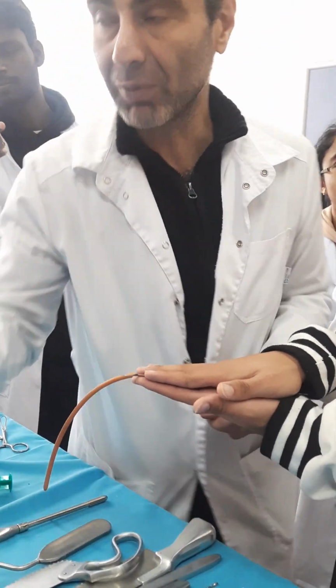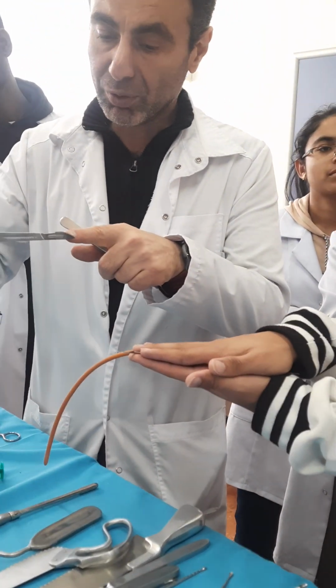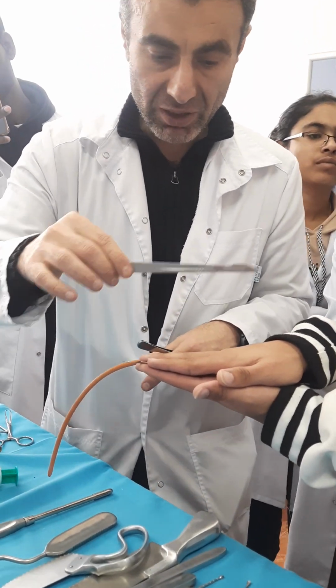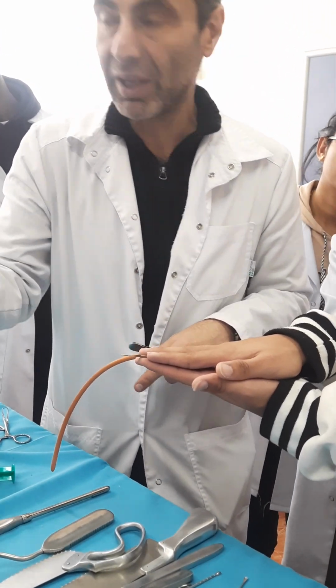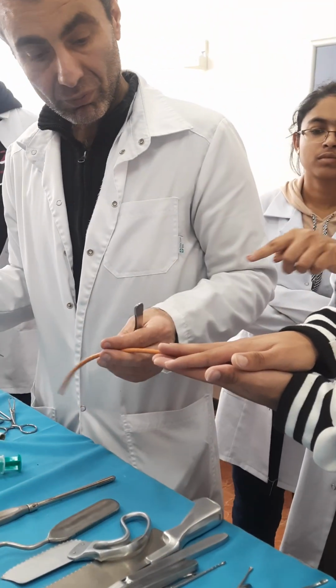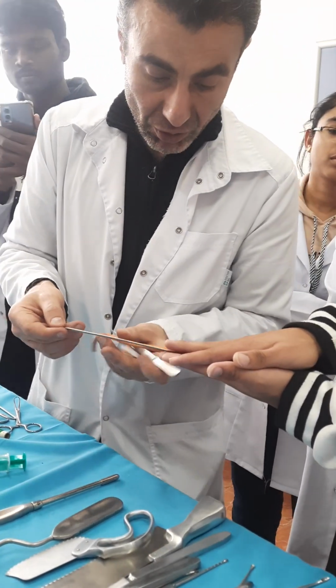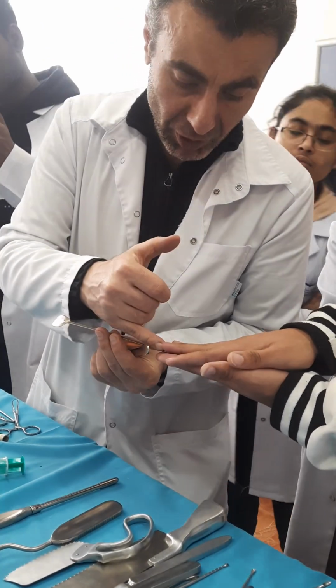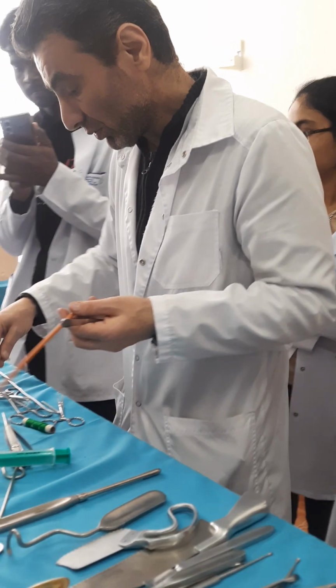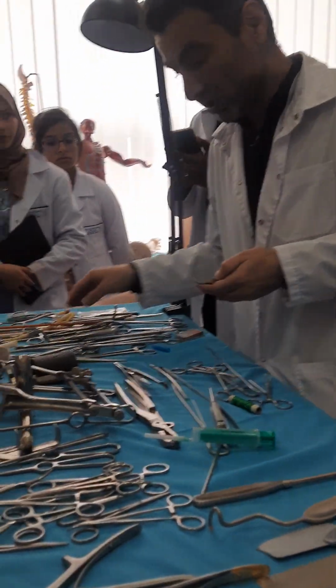What after this? I will take the scalpel. Strongly, I will put the blade in an upward-looking position. And sliding along this groove, I will cut the upper layer so as not to damage the lower one. I think it is simple. So are these grooves for support? Of course, you will slide your scalpel along this groove. Follow the groove. That's how it will protect all deeper located structures.